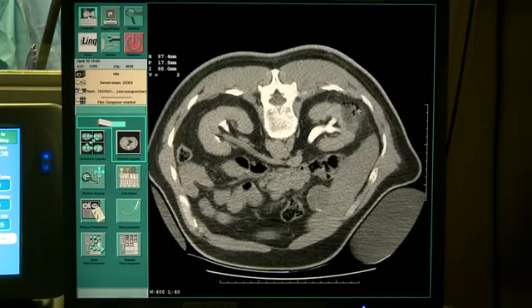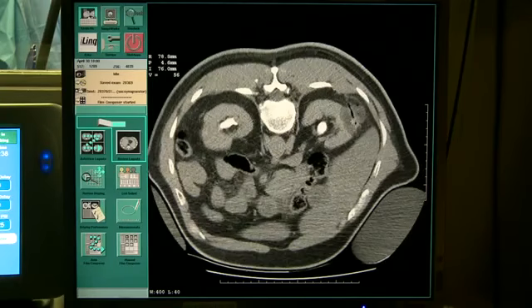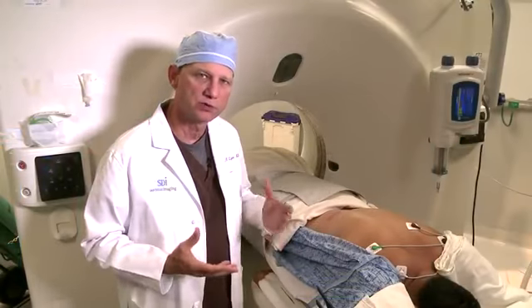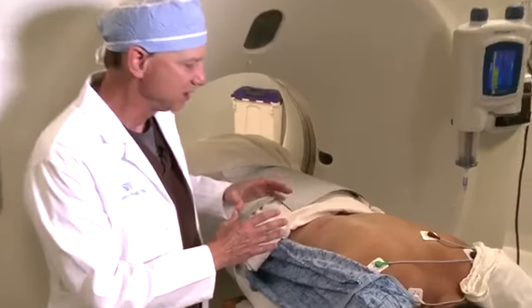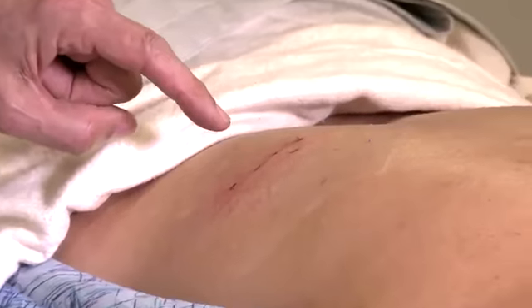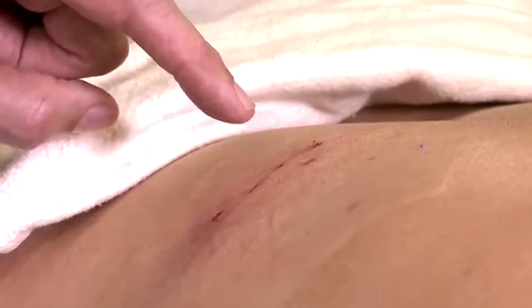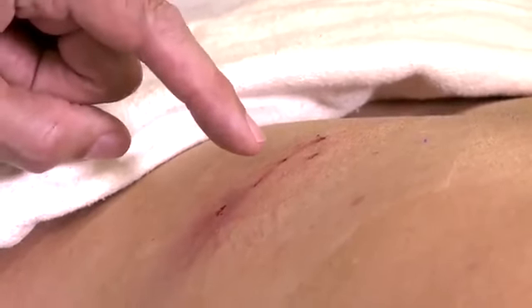And that's pretty impressive, I think, that this technology is really so safe. Just wanted to point out one of the most remarkable things about this procedure in my mind: this guy just had a renal tumor taken care of, almost certainly a malignancy, and this is what he's left with. He's got 4 little puncture marks. If you had a big Band-Aid, you could cover it with a Band-Aid. And this is not lost on the patients.